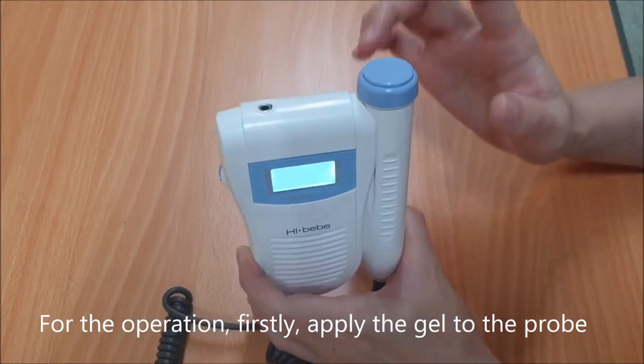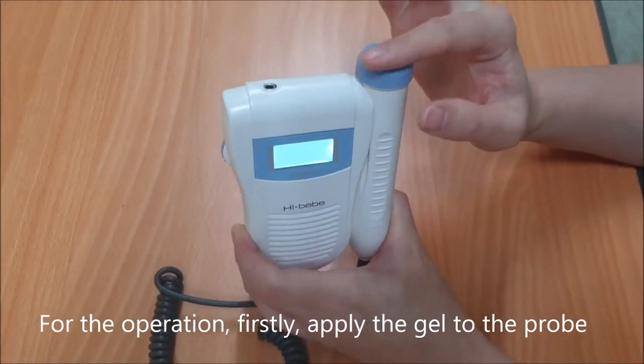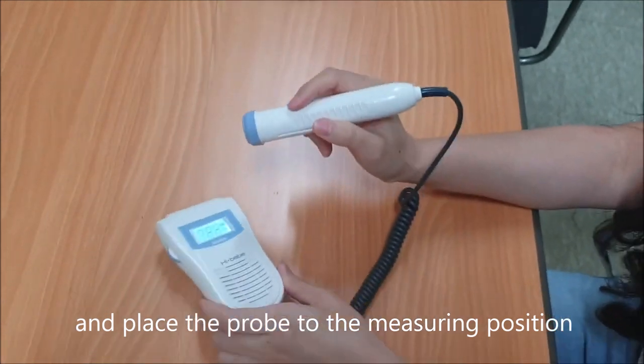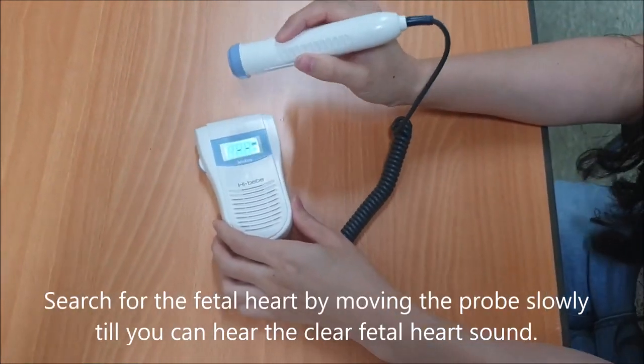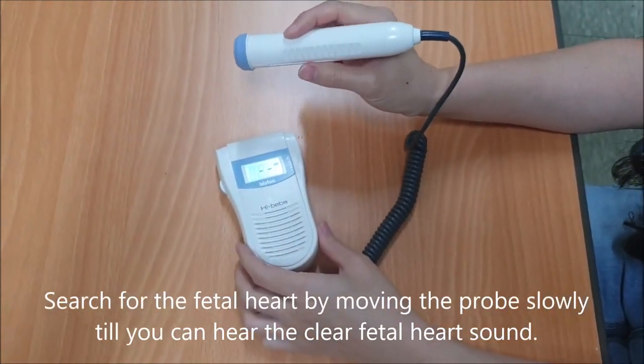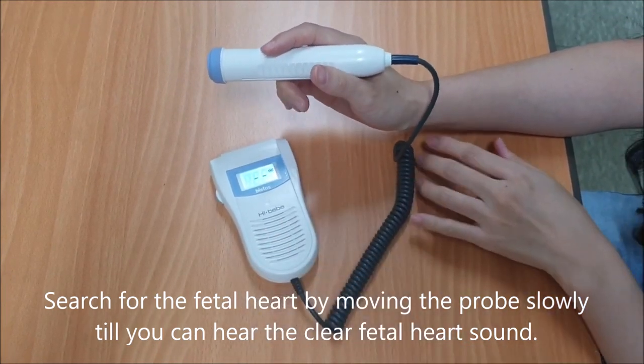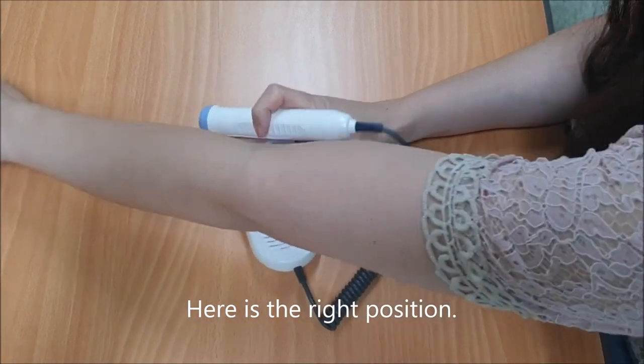For operation, firstly apply the gel to the probe and place the probe on the measuring position. Search for the fetal heart by moving the probe slowly until you can hear a clear fetal heart sound. Here is the correct probe position.